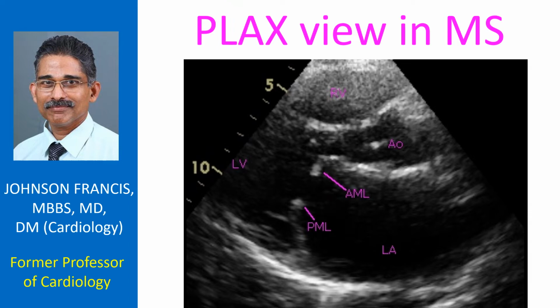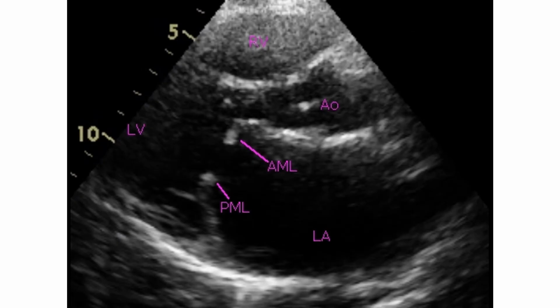Left atrium is dilated as a sequelae of mitral stenosis or associated mitral regurgitation, which can only be documented by Doppler, either color Doppler or continuous wave Doppler. Fair diastolic separation of the tips of mitral leaflets indicates that the mitral stenosis is unlikely to be severe. Hence, the left atrial dilatation is likely to be due to significant mitral regurgitation.